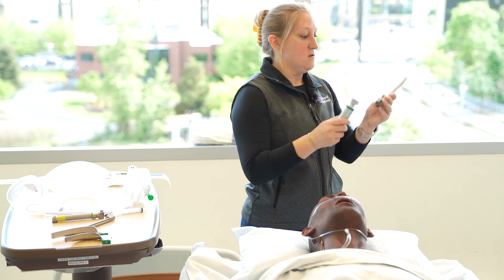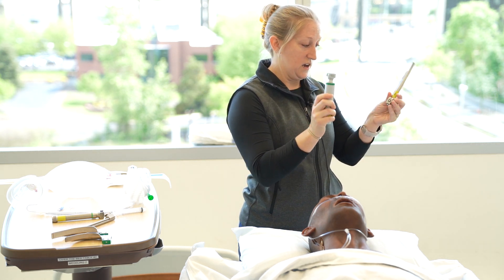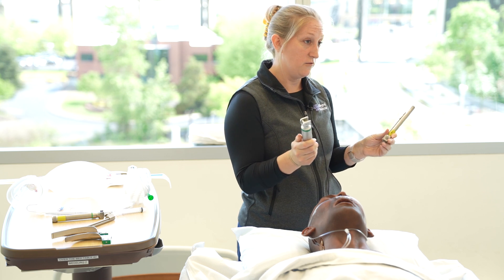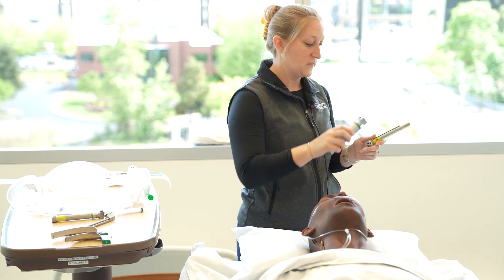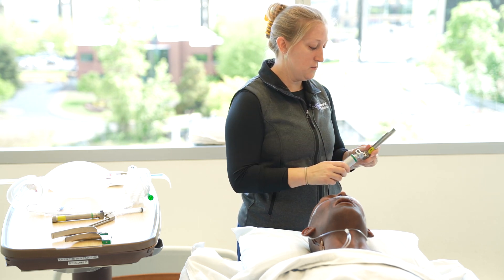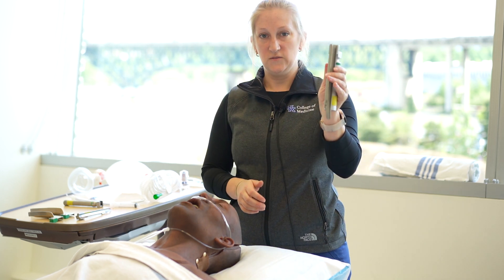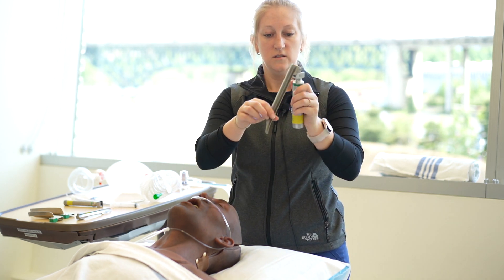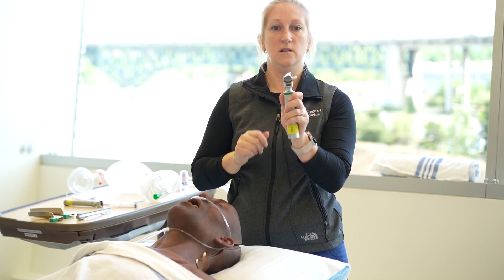Using direct laryngoscopy right now — in case you guys aren't familiar, these are the handles and blades that are going to come in most of your emergency airway kits on the floor if you don't have a GlideScope. I encourage you to know how to set these up. You can see when it's folded down it's attached to that little bar back there; when it's folded up, your light comes on.